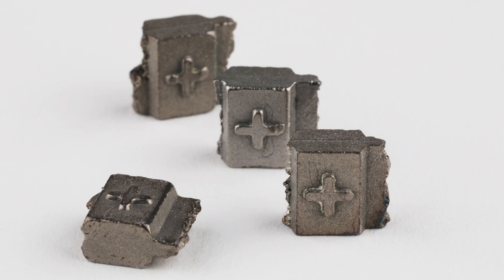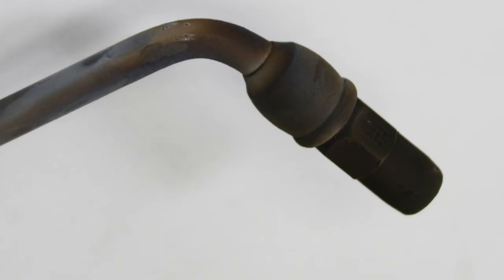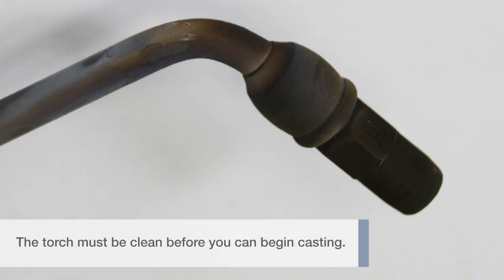Platinum Plus is a hybrid alloy containing platinum, ruthenium, and cobalt. The torch must be clean before you can begin casting.